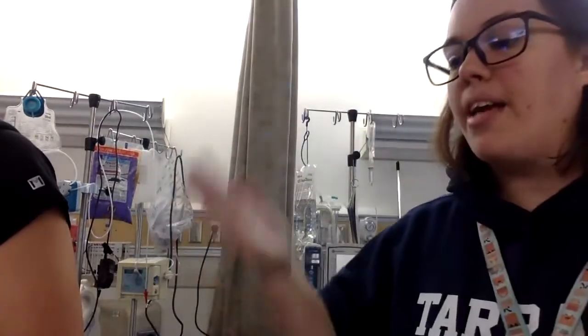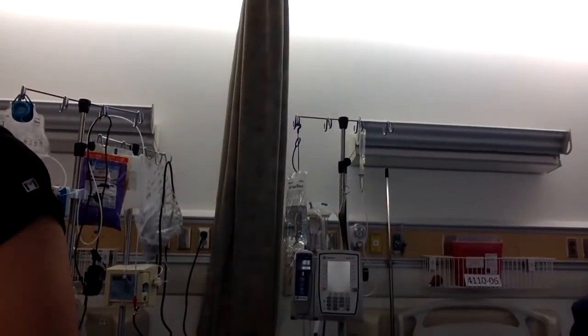Okay, so once I have identified that I have the right patient, right medication, I've washed my hands, checked my orders, scanned everything, all those beautiful parts of med administration, I am going to grab my med and start to get ready to administer it. So let me create some room here so you can see this.